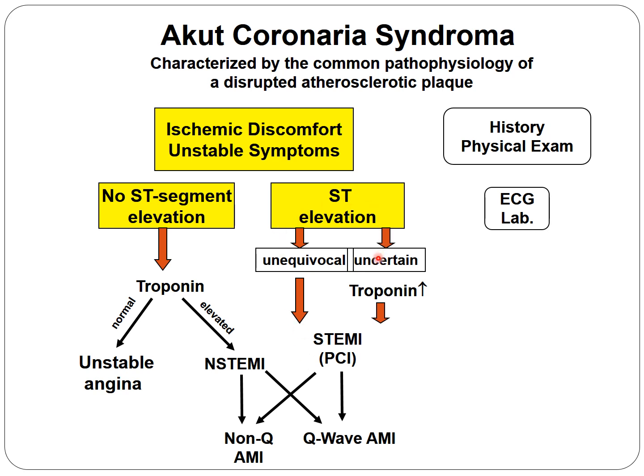However, when we are not certain whether this ST elevation can be behind these clinical symptoms or features, the troponin level is informative. And when the troponin level is high, very similarly, go to the coronary unit and implant the stent or perform the dilation of the coronary. Otherwise, when the ECG does not show any such changes, there is no ST elevation, at maximum we have an ST depression or T inversion, so the sign is not supporting the diagnosis of myocardial infarction. This is when we have to rely on the troponin level.